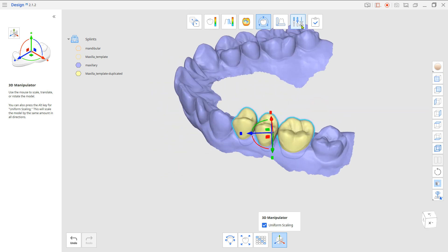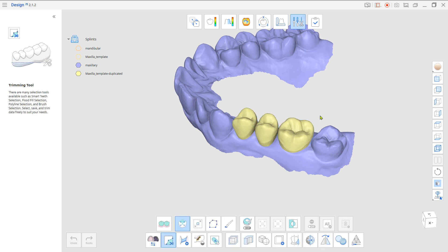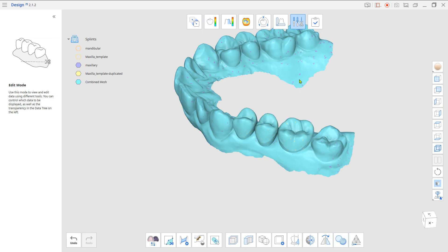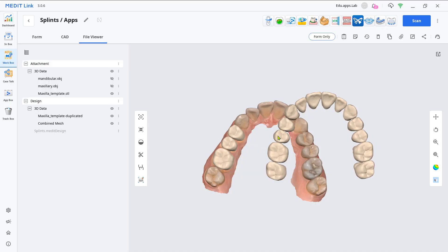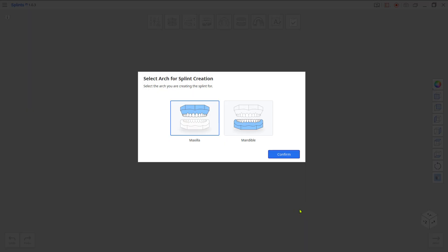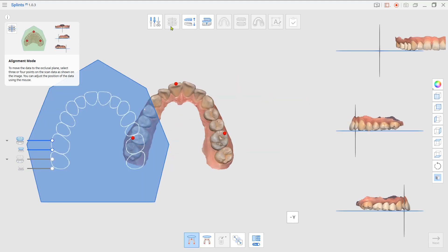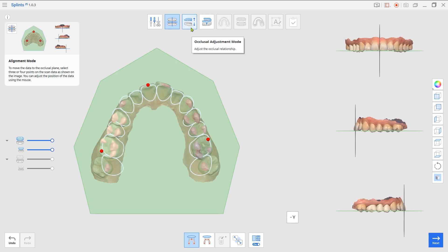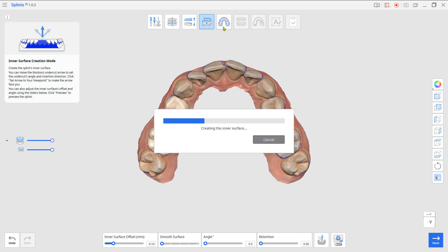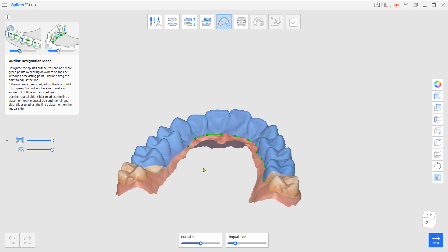Go back to Edit Mode and use Combine to merge them together. Now load the Splints App and use the combined mesh as a replacement for the missing teeth data. Now you can complete the Splint Design.